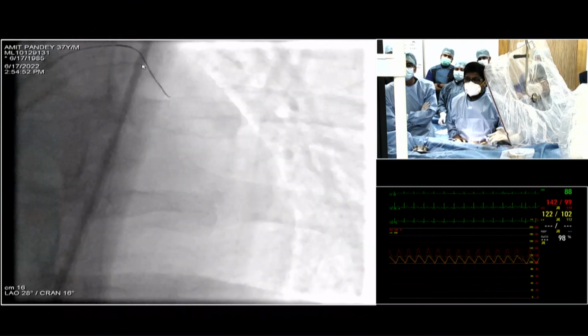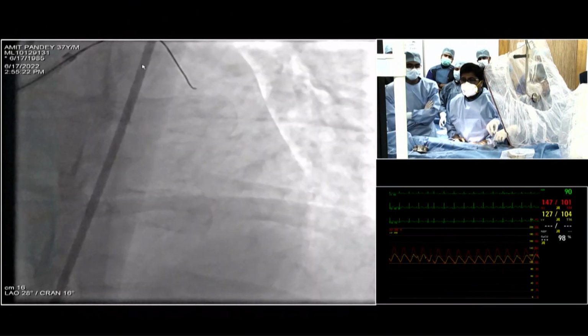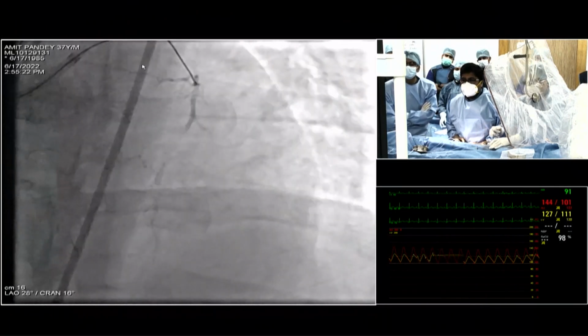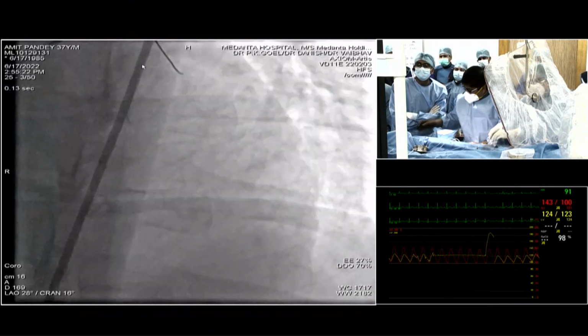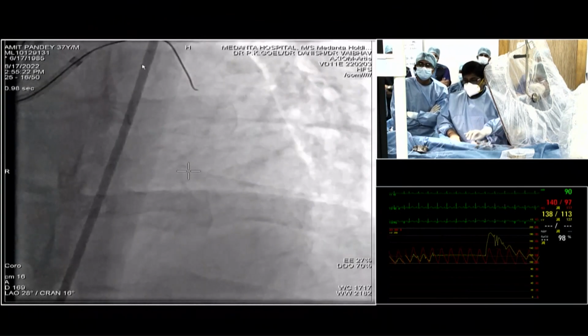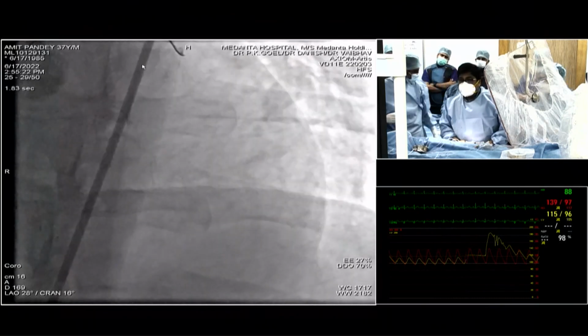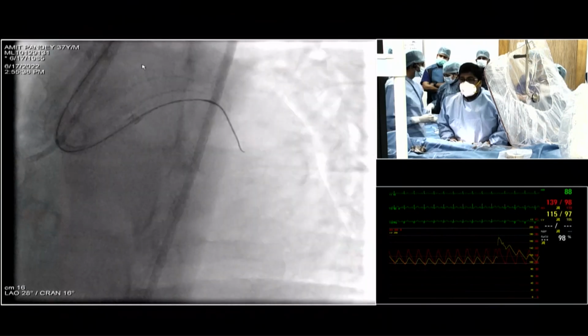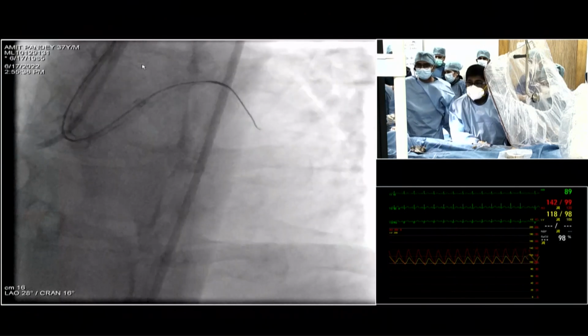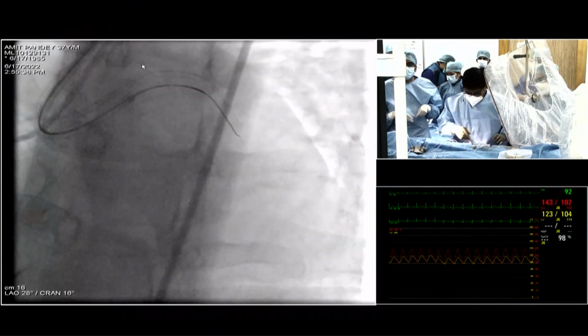Dr. Goel, when we last left you, you were suggesting to use a double lumen catheter, right? Yeah, I think I need to. I'll use a double lumen. Actually, I was trying to redirect it, but I don't think it is correct. Because initially when I was trying to get the double lumen in, my guiding came out. So then I had to rewire it as such. So that is why I went into this.